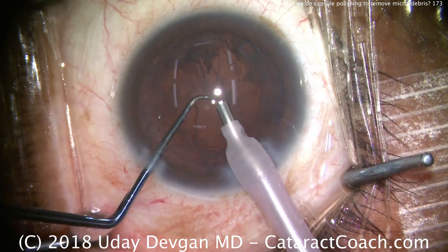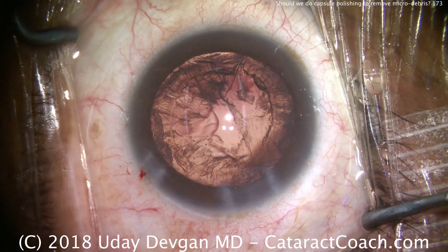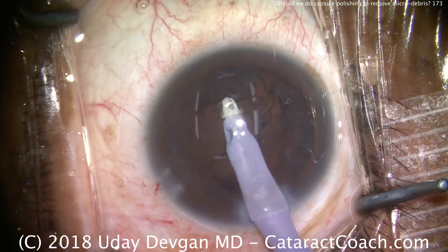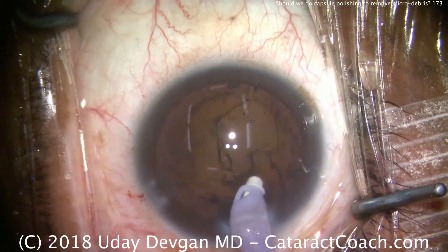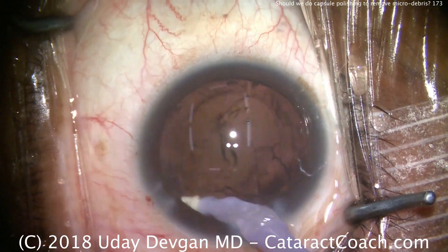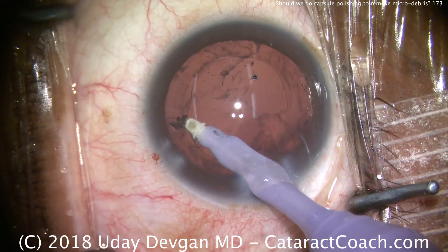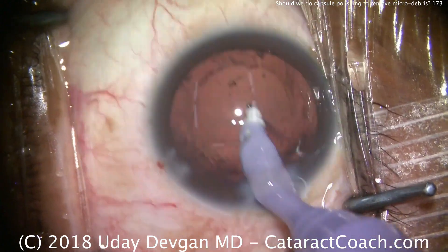Now we're going to use the irrigation-aspiration to remove the cortex. Because I've adjusted the lighting, you'll see there's a beautiful, very strong red reflex. The IA probe goes in the eye removing the cortex, and we'll go around. You're going to notice there's a lot of lens material — micro-debris, tiny stuff — on the undersurface of the anterior capsular rim. Just removing the cortex first, and that reflex will allow us to see that there's a lot of material on the undersurface.